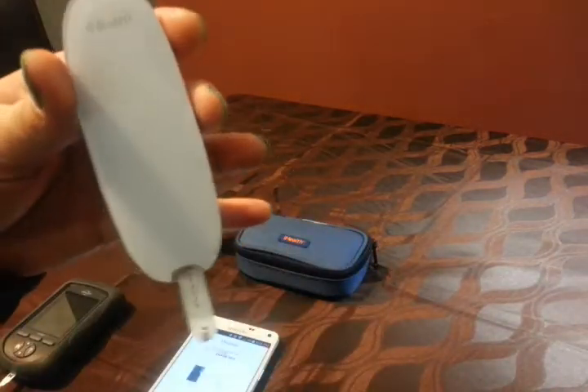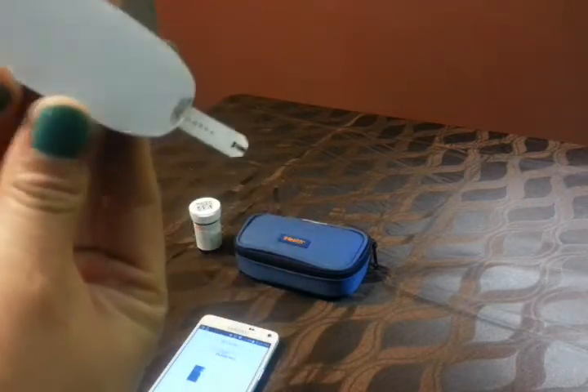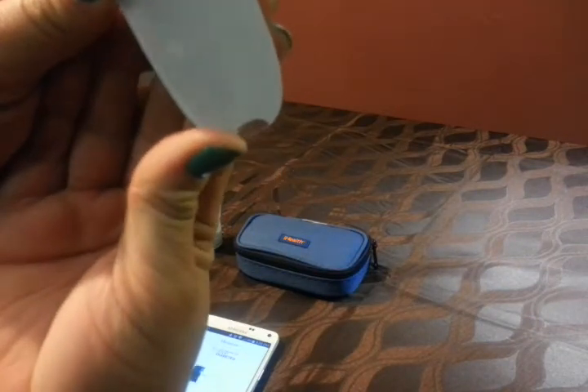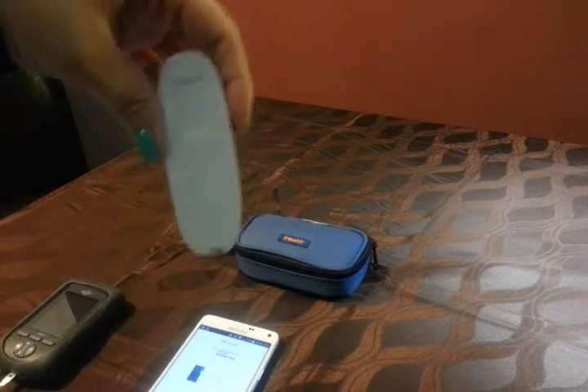And then I found out what this thing is for — it ejects the test strip. Now let's see if it works when I do it. Oh, it totally shot it out.